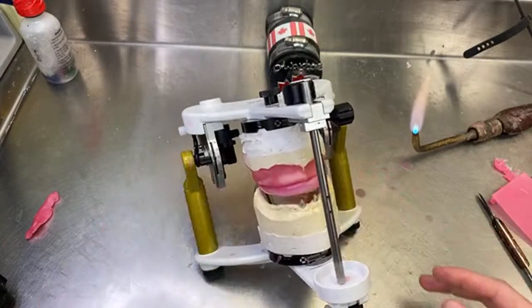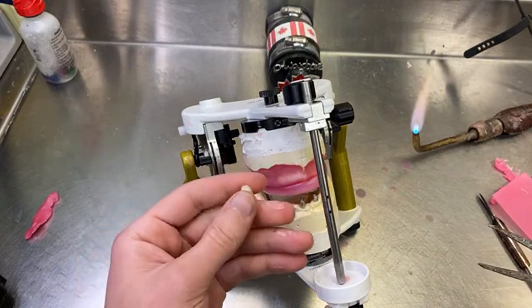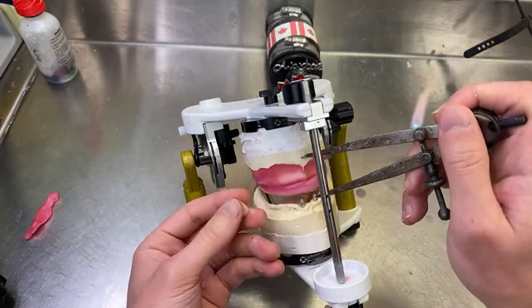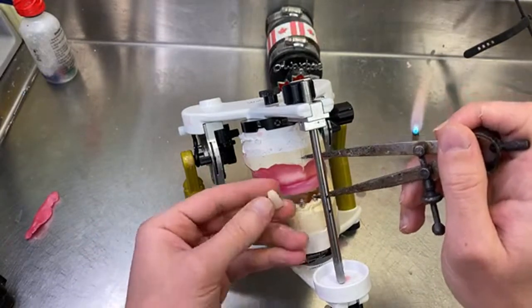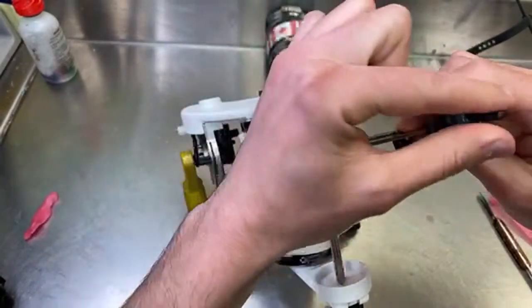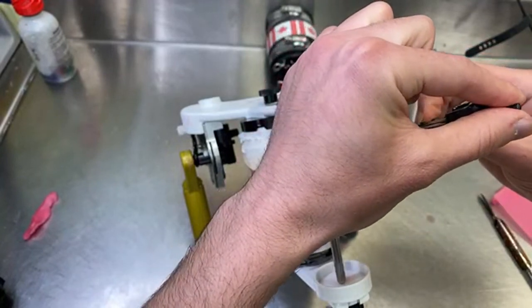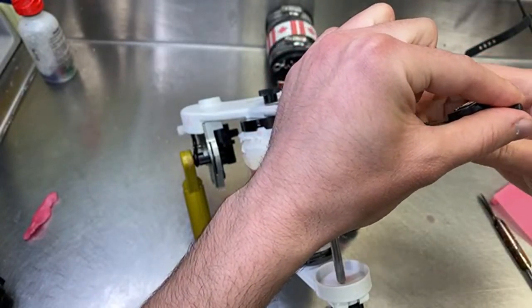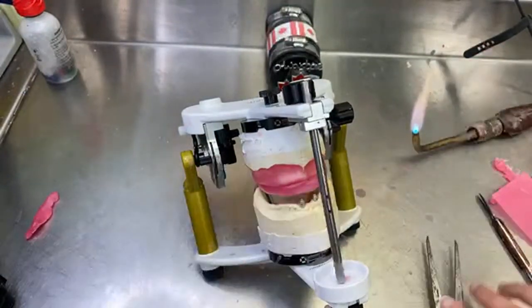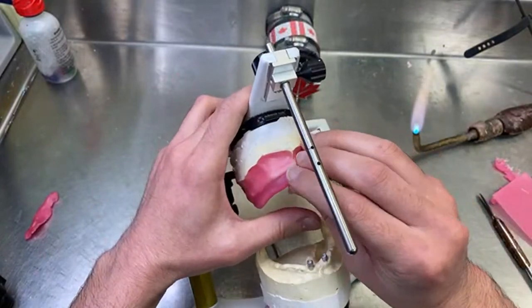Okay, now the best part, setting the teeth. So I have those teeth here that we selected for the patient, and they love them. You'll see here that I'm using a caliper to mark where my denture is, the old denture I mean, and the teeth in it. Okay, so it goes to about here. So what I need to do is center line, watching the center line always.